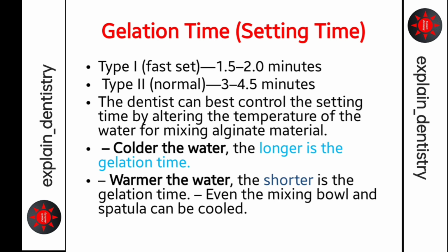The dentist can best control the setting time by altering the temperature of the water for mixing the alginate material. The colder the water, the longer the gelation time. The warmer the water, the shorter the gelation time. Even the mixing bowl and spatula can be cooled.